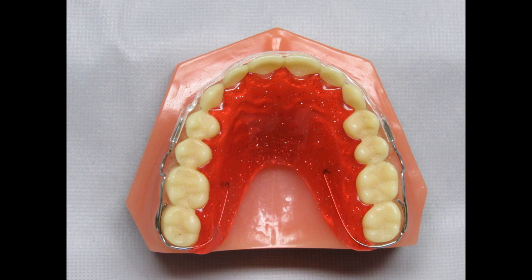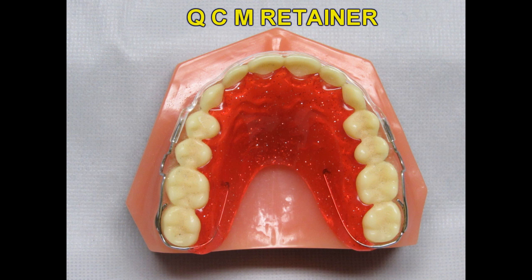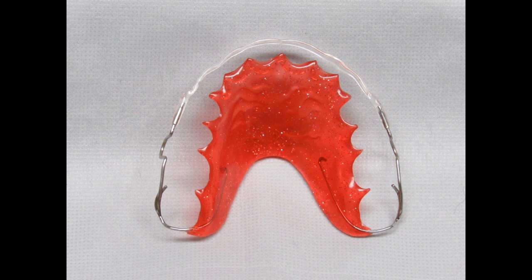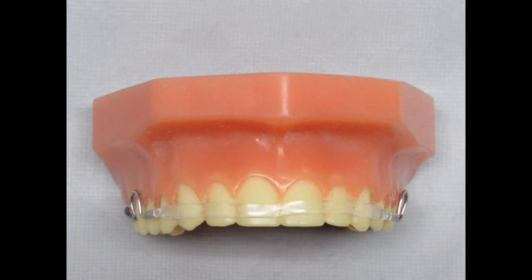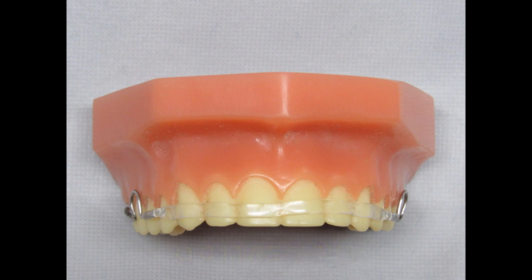One of our newer retainer designs is the QCM retainer. More and more patients, especially adults, are requesting retainers that are not visible — they do not want the labial bow or any wire work to show. A good solution is the QCM retainer. It can be made on the upper or the lower arch. A clear heat-sensitive ribbon of material across the anteriors replaces the traditional labial bow. The QCM material is heated to conform tightly to the facial and interproximal of the anterior teeth. This material is very strong and does a great job of maintaining the teeth in their new positions. This is a great alternative for adult patients completing Invisalign treatment — one QCM retainer will last much longer than a series of Vivera or Essex retainers and it is much less expensive.